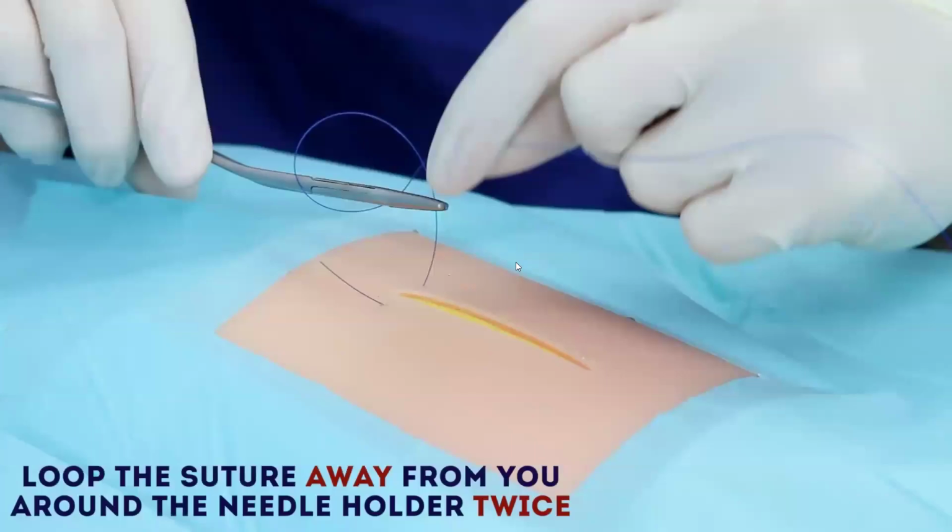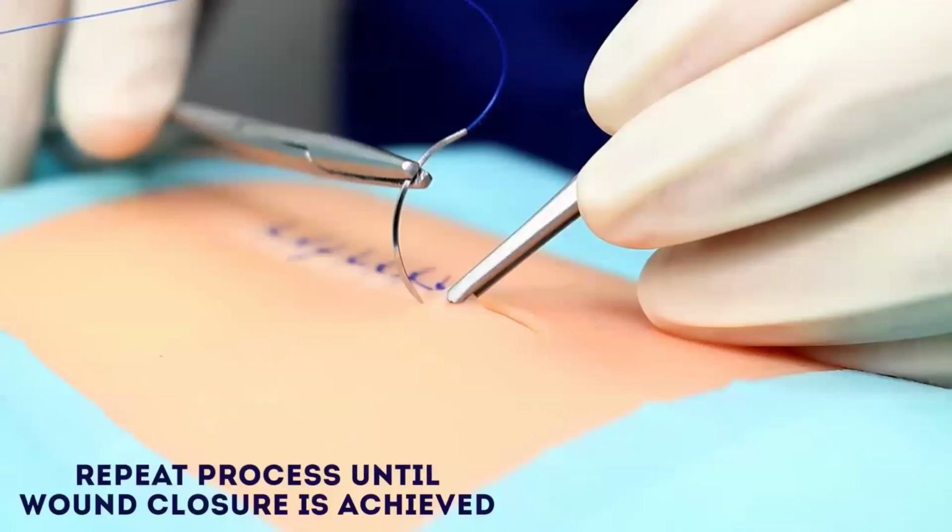So half centimeter, not 1 centimeter. If you mention 1 centimeter, no worries. It's up to you. Whatever, half centimeter or 1 centimeter. The most important, don't touch the needle itself. Okay. Well done. Thank you. Okay. Next station.